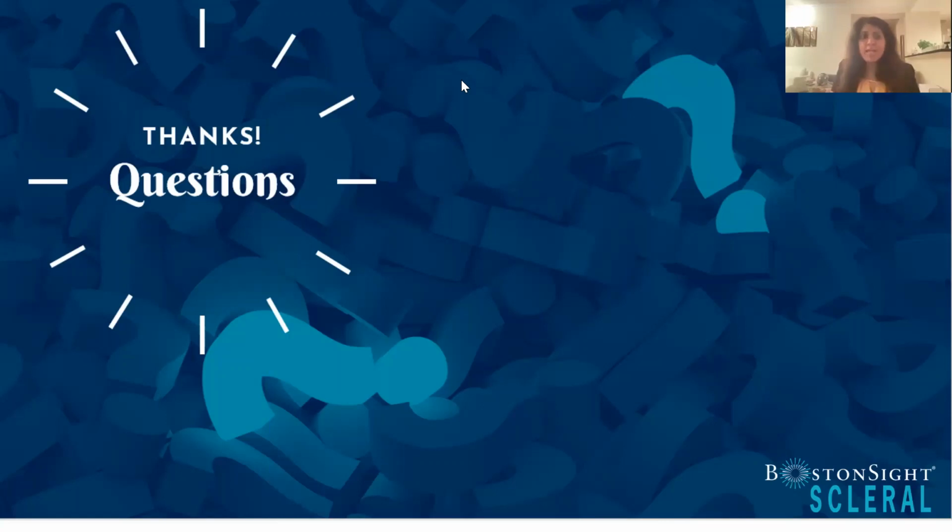I do my initial scan, I look, and then I'll go and take my notes. I'll be like, just give it a couple of seconds, give them a Kleenex, so dab the rest of the extra. A couple of minutes later, I'll go back and take another look and bring that Wratten filter out to make sure I'm not missing anything.